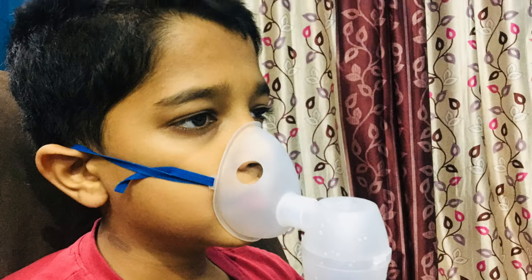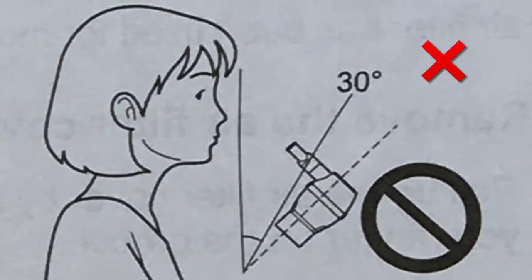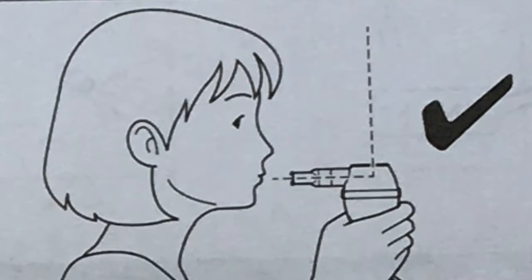If using the mask, adjust the band to fix it properly. If using the mouthpiece, do not tilt up or down. Always keep it straight as you see.